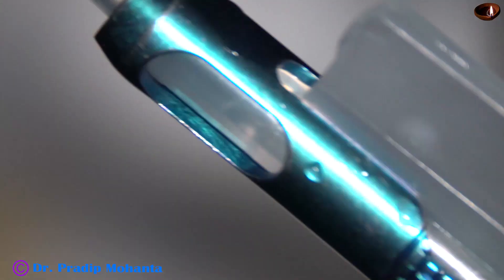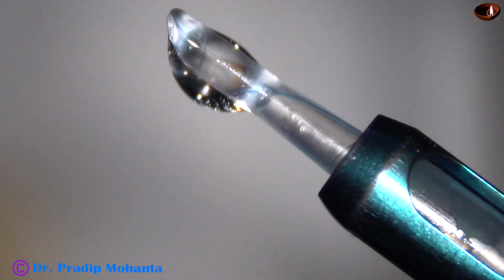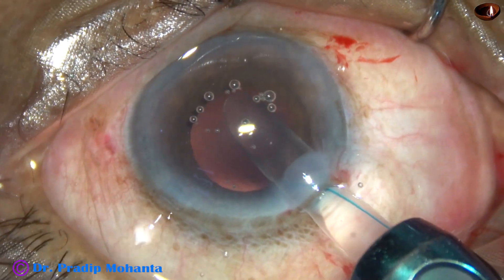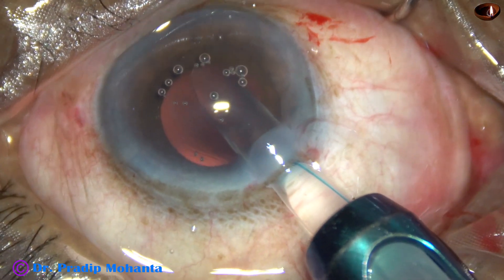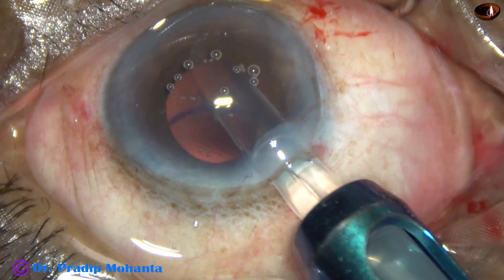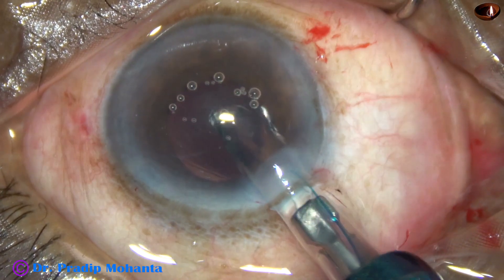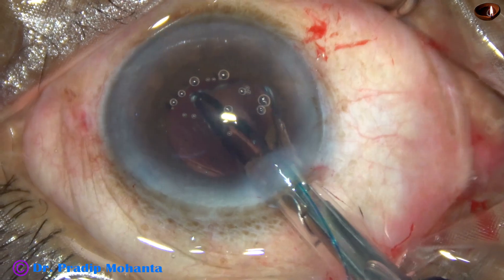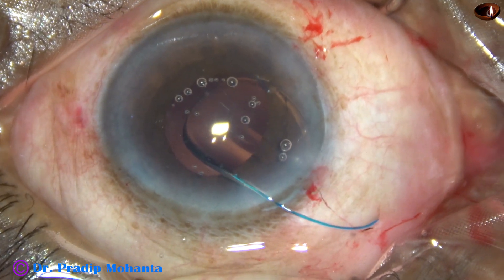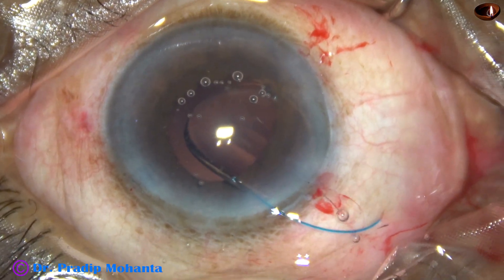The trailing haptic should come outside in the correct way. The piston is pushed forward and rotated clockwise. The cartridge is rotated clockwise first so that the haptic goes in the proper direction. As the optic comes out, the cartridge is rotated anticlockwise so that the trailing haptic is in the right position.